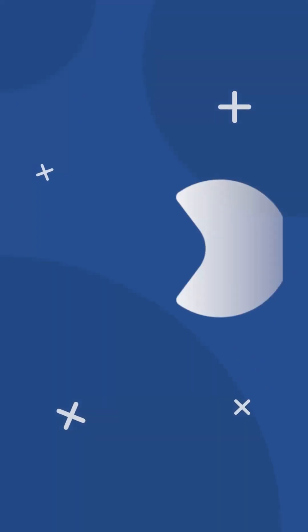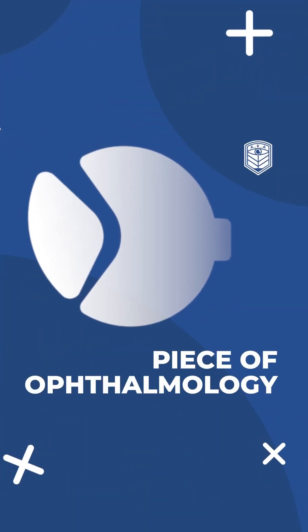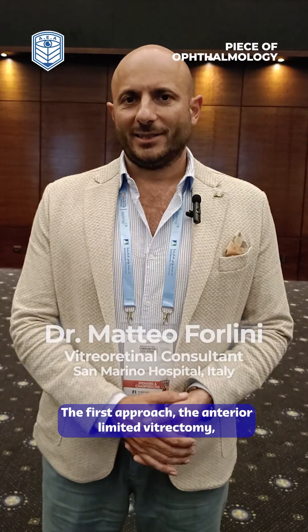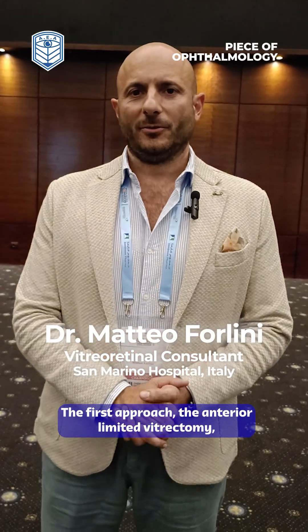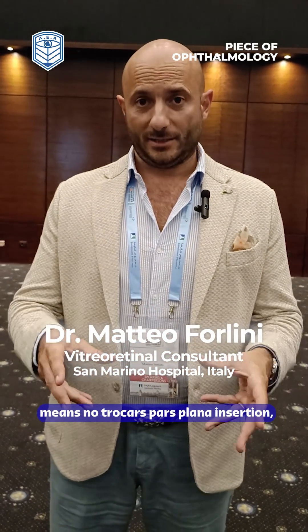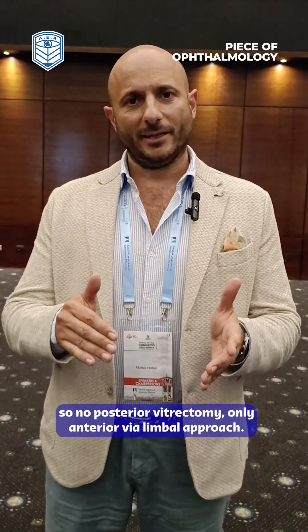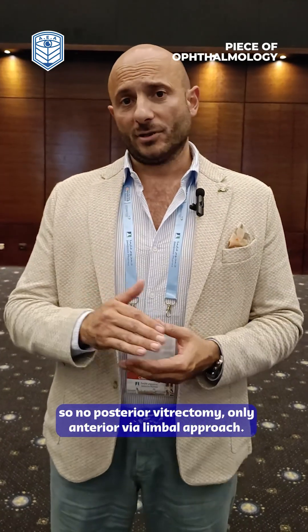When to perform only anterior limited vitrectomy and when to perform complete pars plana vitrectomy in case of secondary implantation. The first approach, the anterior limited vitrectomy, means no trocars pars plana insertion, so no posterior vitrectomy — only anterior via limbus approach.